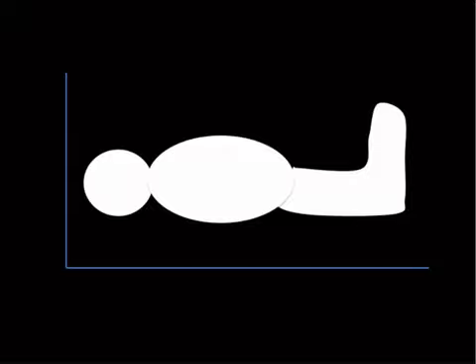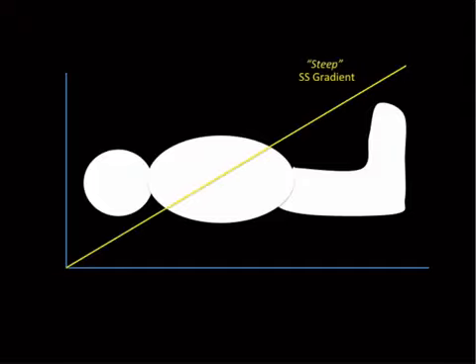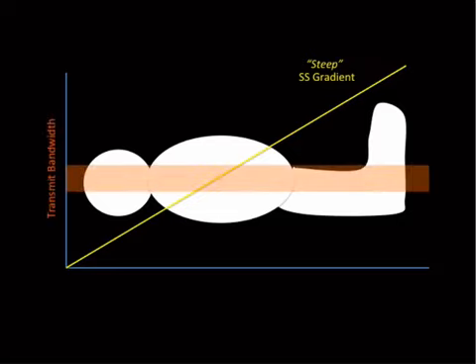That's why it's not just one dot. It's a range. It's a bandwidth. And as the RF is being transmitted at this point, it's specifically called a transmit bandwidth because that's the one that's transmitted. All right, so let's sort of cartoon this out and take a look. So this is a steep slice-select gradient, and here is a transmit bandwidth.